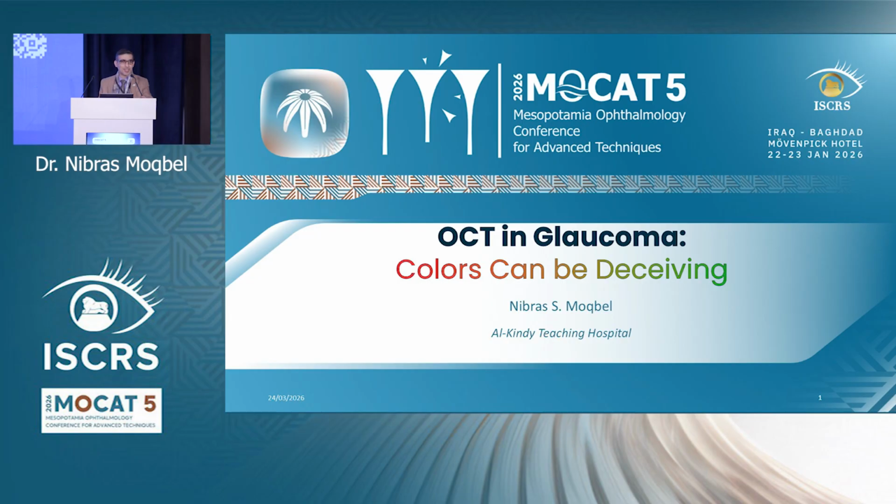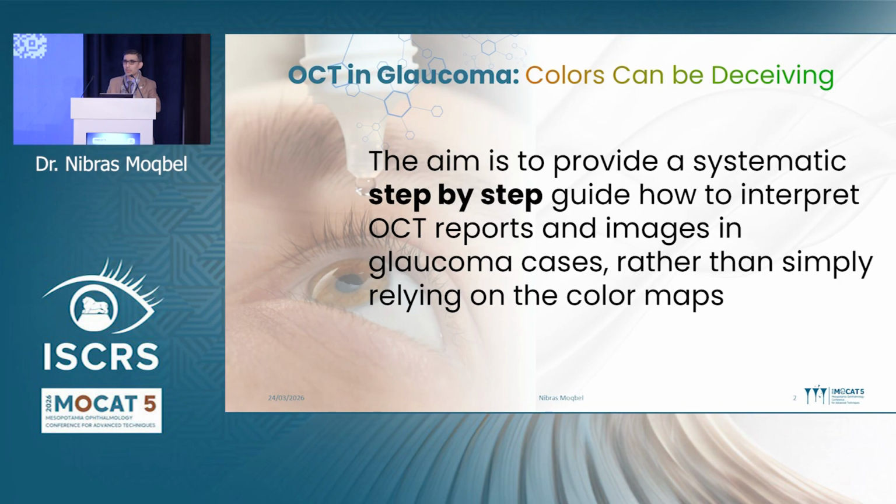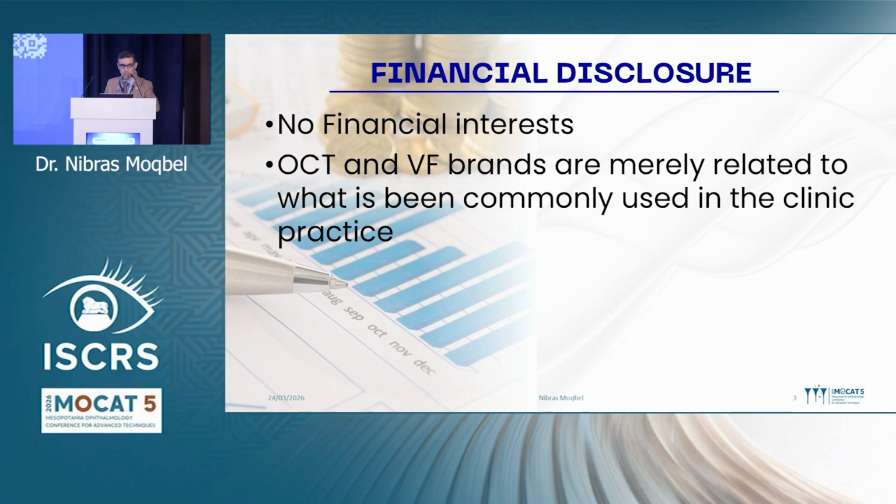Excellent. So today our presentation will be about OCT in glaucoma, in which colors can be deceiving. It's important for the day-to-day practice of ophthalmologists because we face that so often. I have no financial interest, and the OCT and visual field brands are what we commonly use in clinical practice.